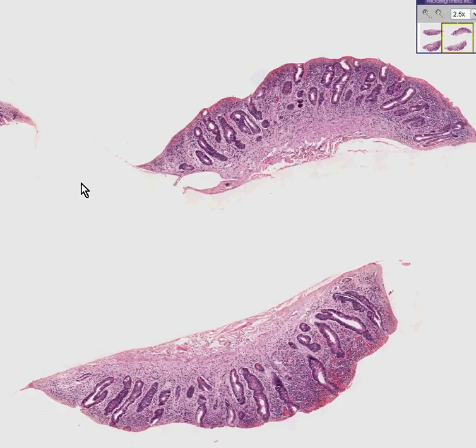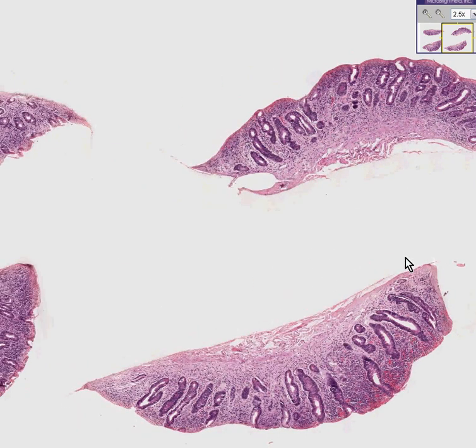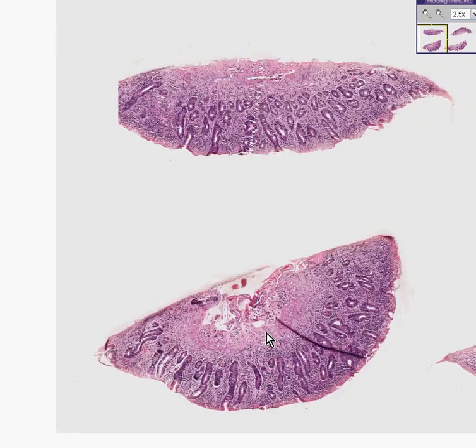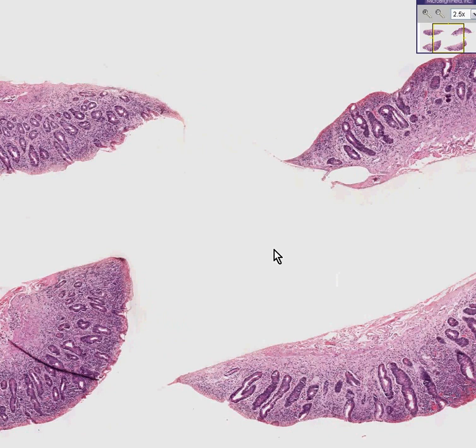If I told you that these were small bowel biopsies here, here, here, and here, you probably wouldn't believe me. You would say, Dr. Manarsek, this isn't small bowel at all. Everybody knows that small bowel has villus or papillary-like projections along the mucosa. This mucosa is flat and has pits. This looks more like large bowel than small bowel. Why are you trying to fool me?